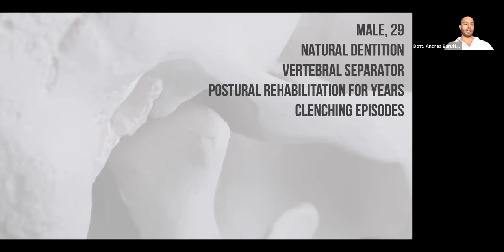Then he had pain, so he removed this separator, and he underwent postural rehabilitation for years. He came to the clinic because he noticed that he had started to have clenching episodes during the day and probably bruxism during the night.